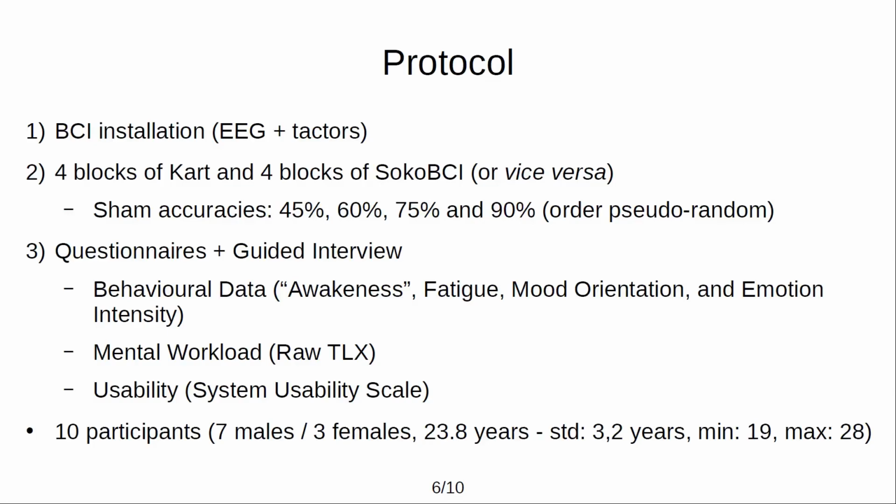It could be a behavioral data questionnaire, like how awake or fatigued do you feel, and so on. We also assess the mental workload using a raw TLX questionnaire. And finally, we measure the perceived usability of the system using the System Usability Scale. At the end of the session, we also have a guided interview in order to discuss the system with the participants. In the end, we had 10 participants in our study.